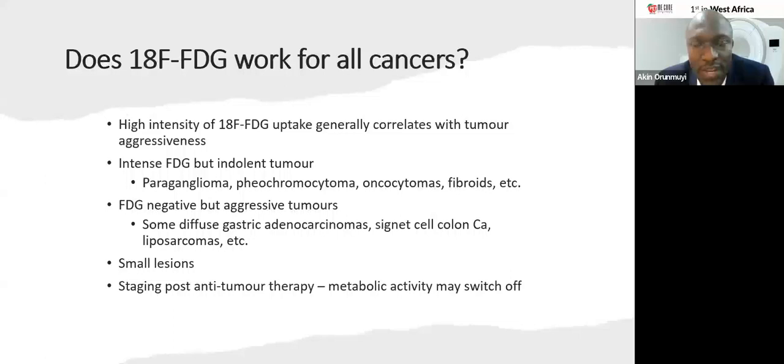So FDG is very useful, but it doesn't work for every cancer. Generally the intensity of FDG uptake correlates with the tumor aggressiveness, but to every rule, there's an exception. Some tumors are indolent, but they have very intense FDG uptake, like paragangliomas, fibroids, and things like that.